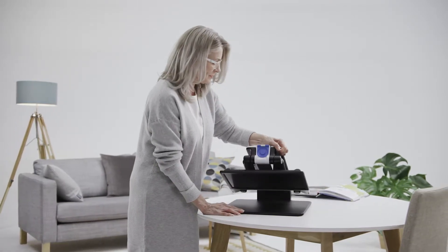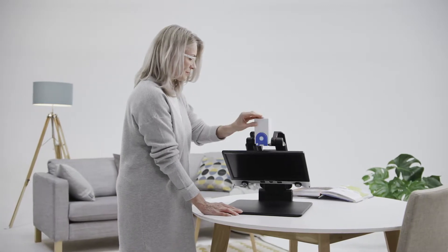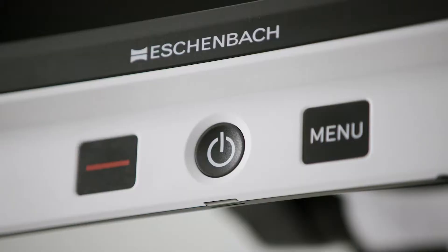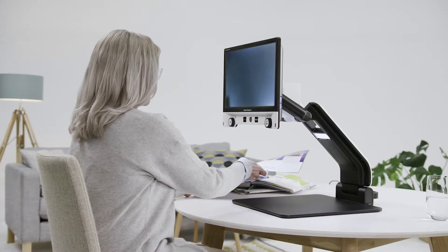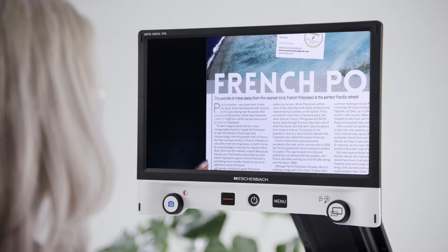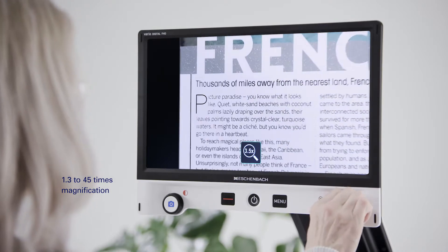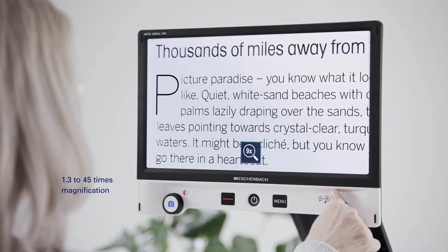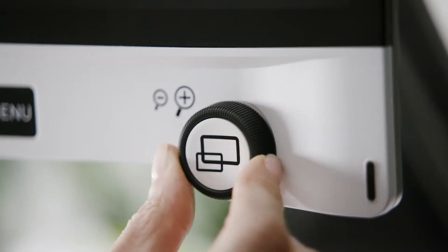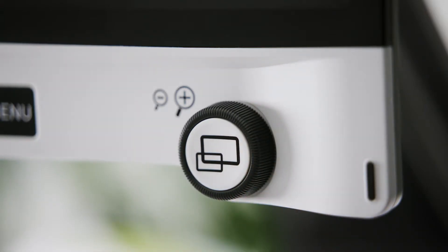The Vario Digital FHD can be quickly and easily unfolded and is then immediately ready to use. Whatever you want to view, the Full HD camera with quick autofocus provides a pin-sharp image. An optical digital zoom provides you with 1.3 to 45 times magnification. You can achieve the magnification you require simply by adjusting the rotary knob.